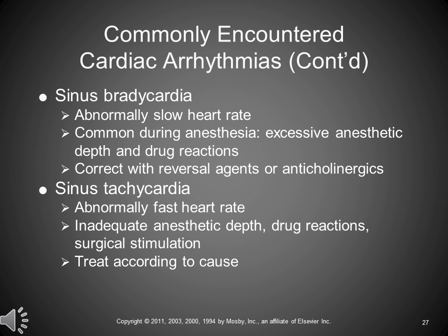Sinus bradycardia. Okay, it's sinus because it's come from the SA node. Bradycardia because there's a slow heart rate. Common during anesthesia. We just depressed this guy. There can be due to excessive anesthetic depth, drug reactions. Okay, we can use reversal agents. We can simply lighten the patient up some. We can give them anticholinergics. Keep the glyco in your pocket.